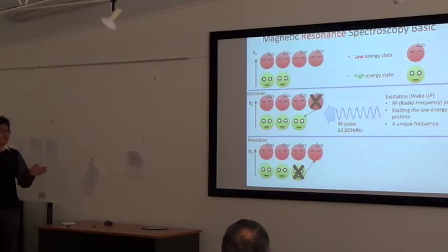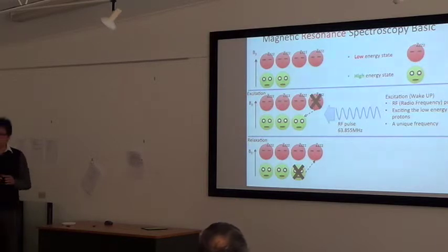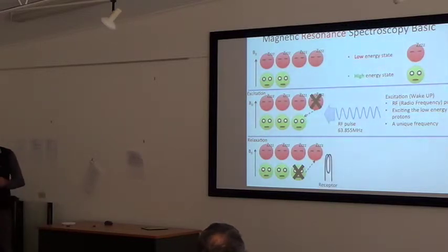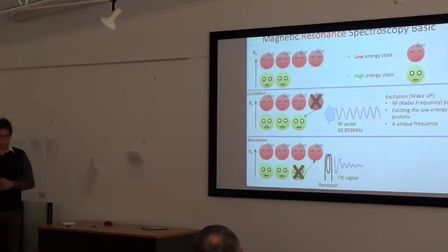You wake up, still physics, let's go back to sleep. So that means that he's transferred from a high energy state to a low energy state. But meantime, he releases the powers to the surrounding. And if we use a receive coil to pick up the signal, we get a free induction decay signal, which is produced by the relaxation.